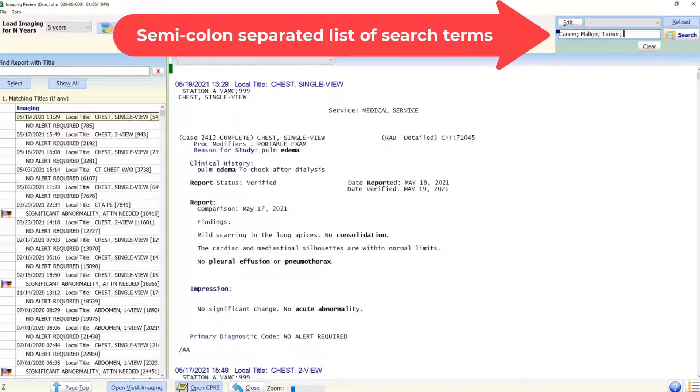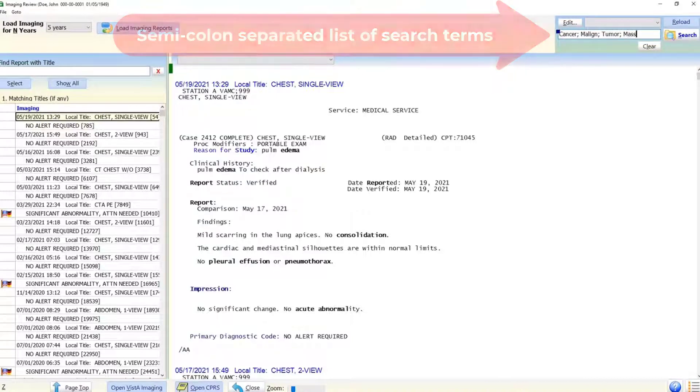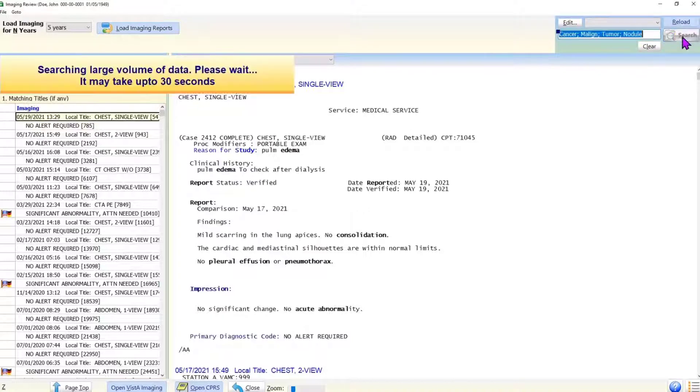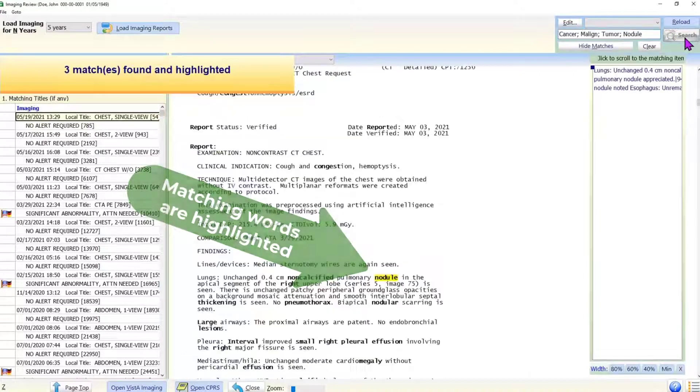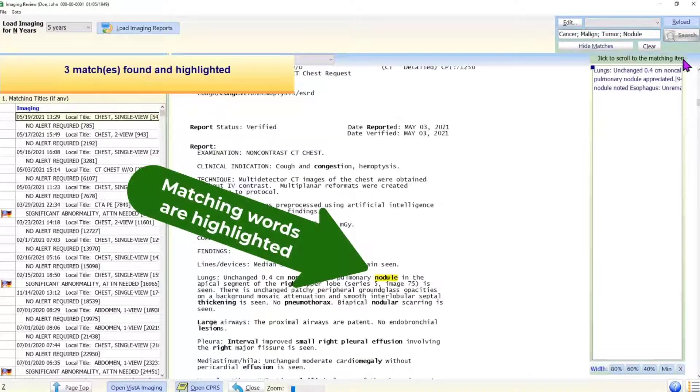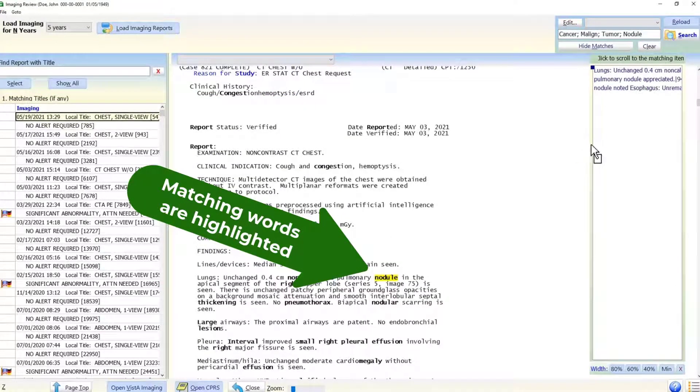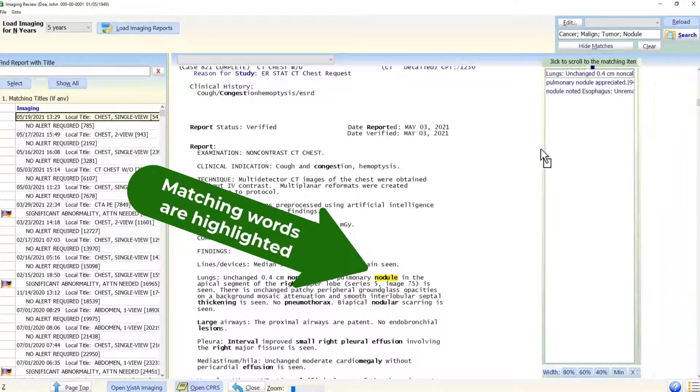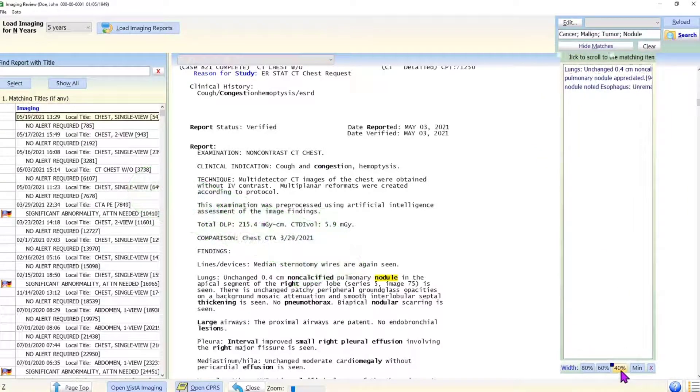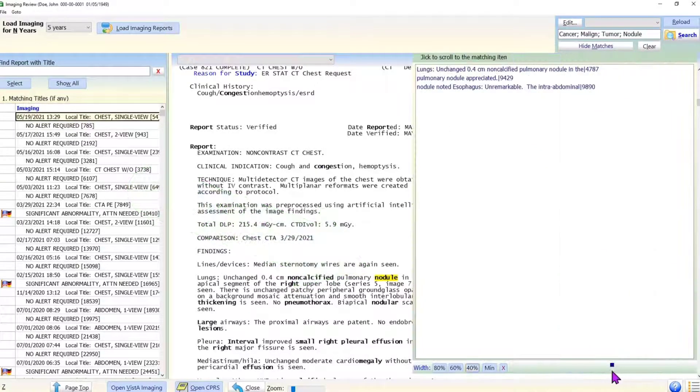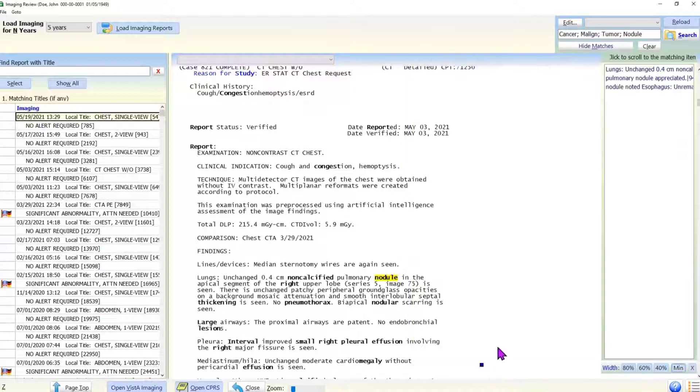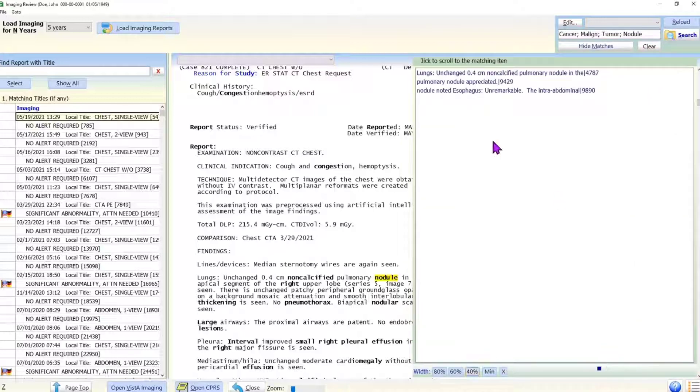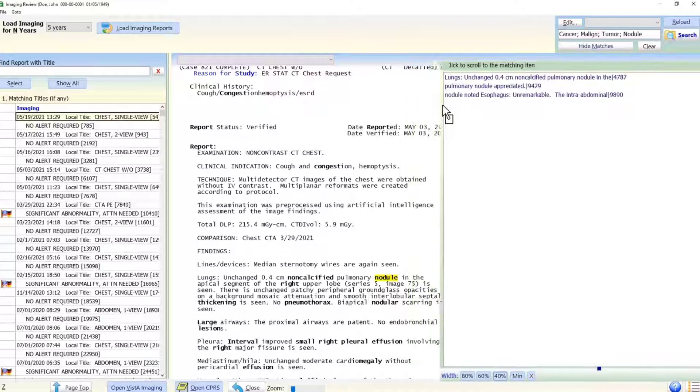Upon search, the matching words are highlighted in the reports text. The optional navigation panel shows matching lines. The panel can be enlarged using the buttons on its bottom. It can be dragged for better positioning. A click on an entry in the navigation panel scrolls the text to the line containing a matching word.